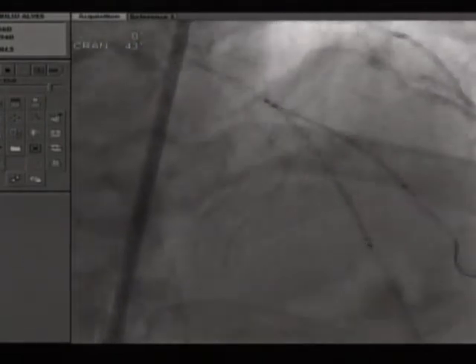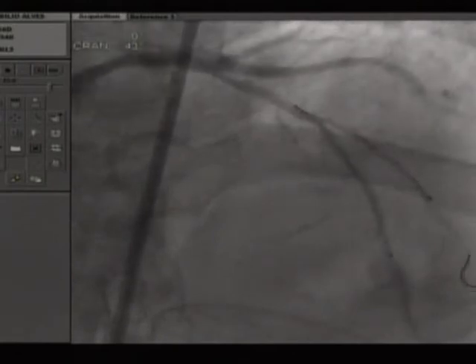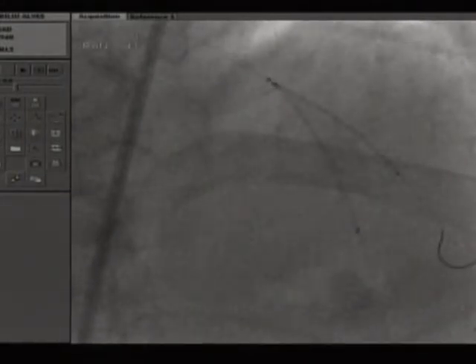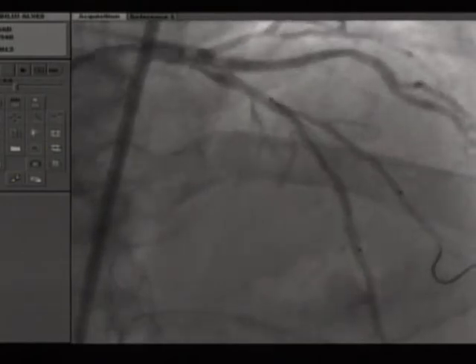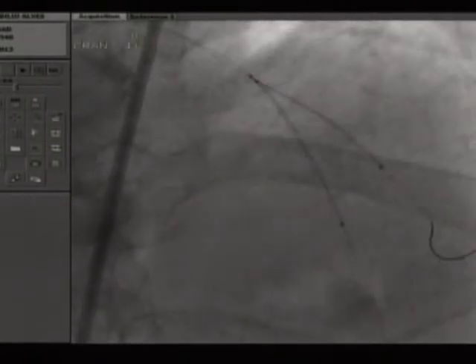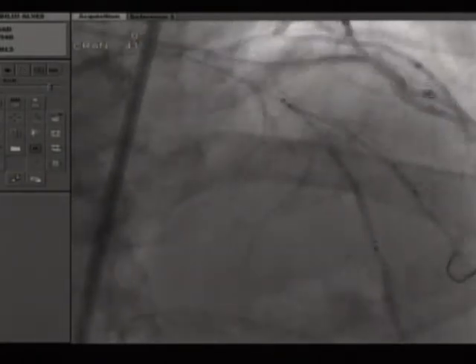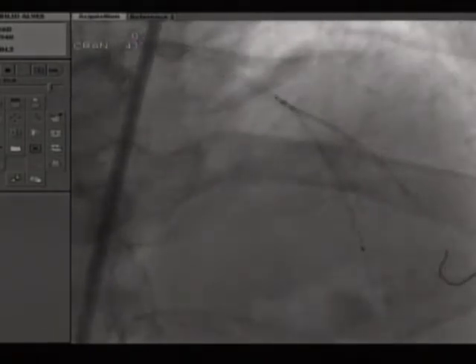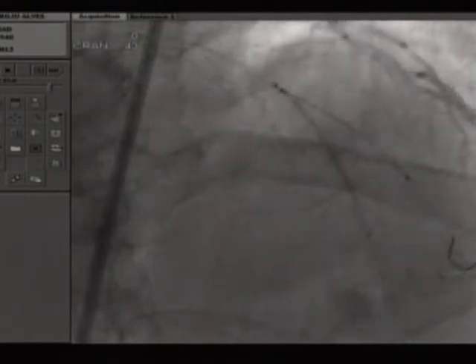Did you get that? I'm going to push a little the LAD and the diagonal too, because you have the two. Perhaps more the diagonal. I think the LAD was in a good position. I think the diagonal now is good, isn't it? Yes. Maybe it's still a little too heavy. You go a little farther, 1 millimeter.